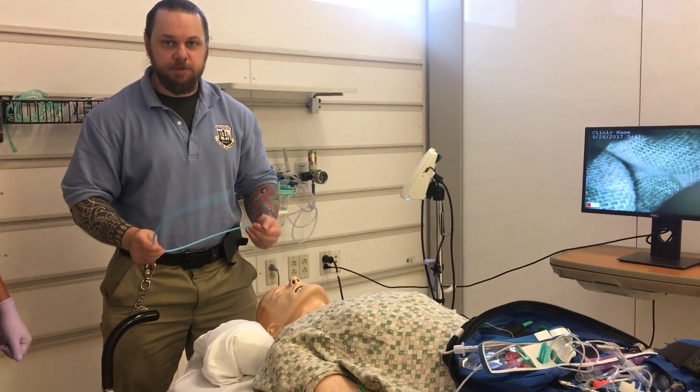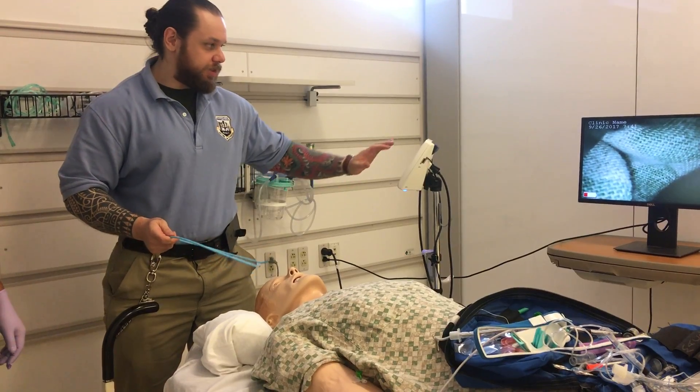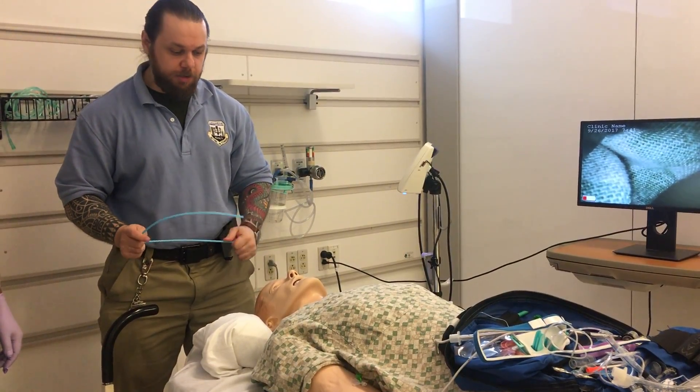I'm going to show you a few things when it comes to direct laryngoscopy and also utilizing a glidescope so you can visualize the airway.